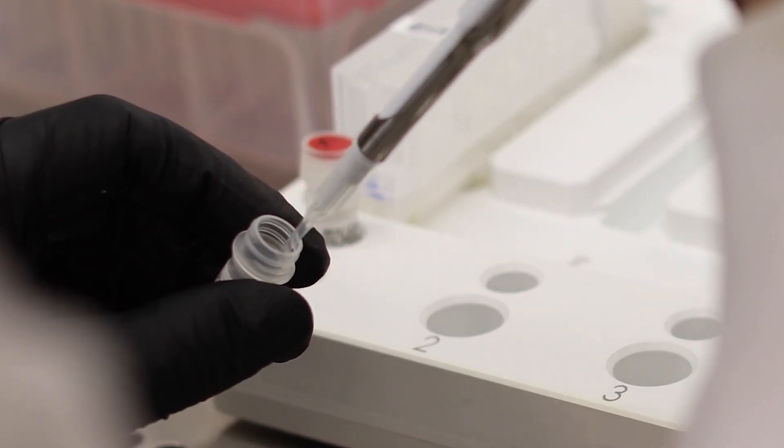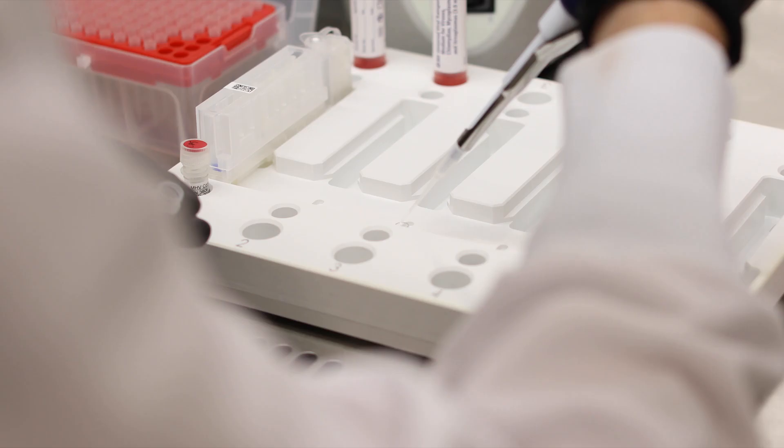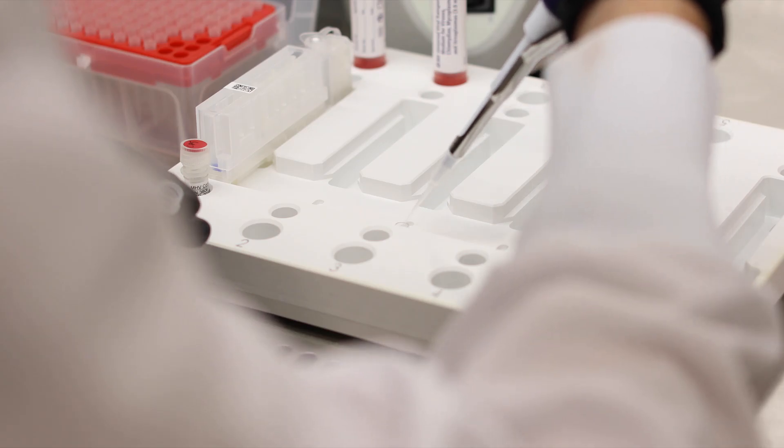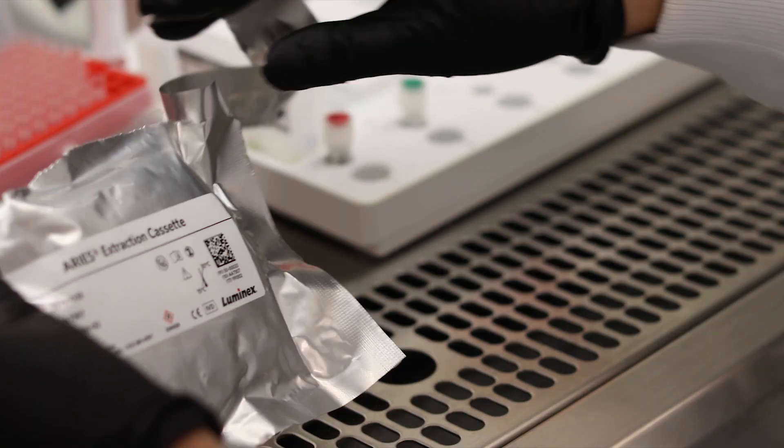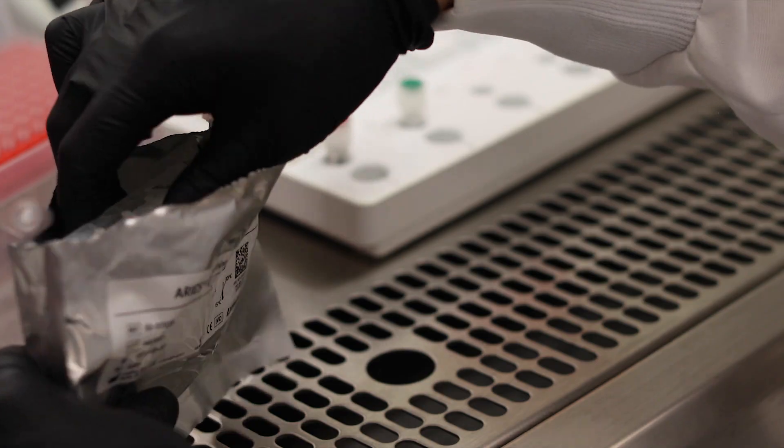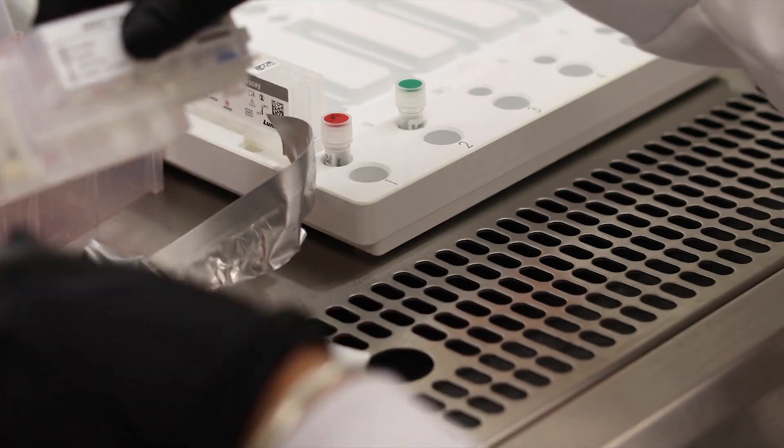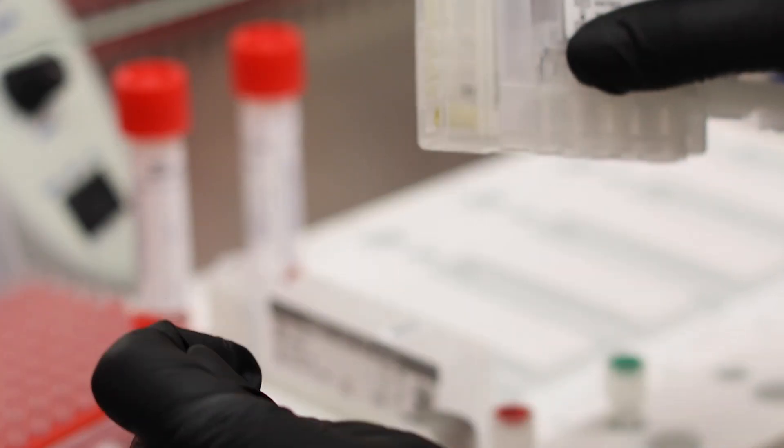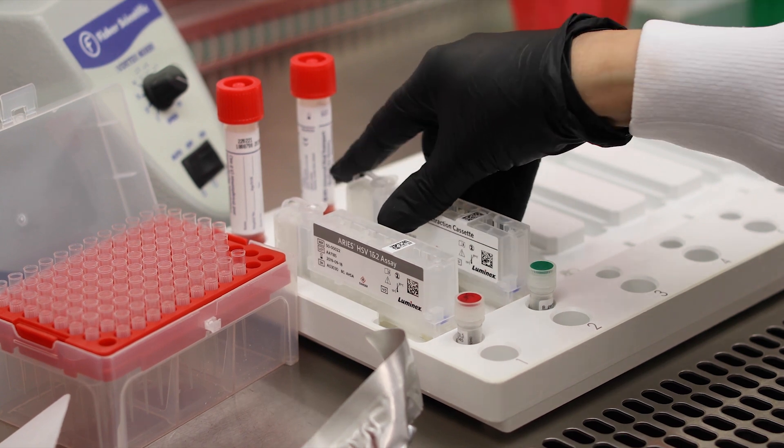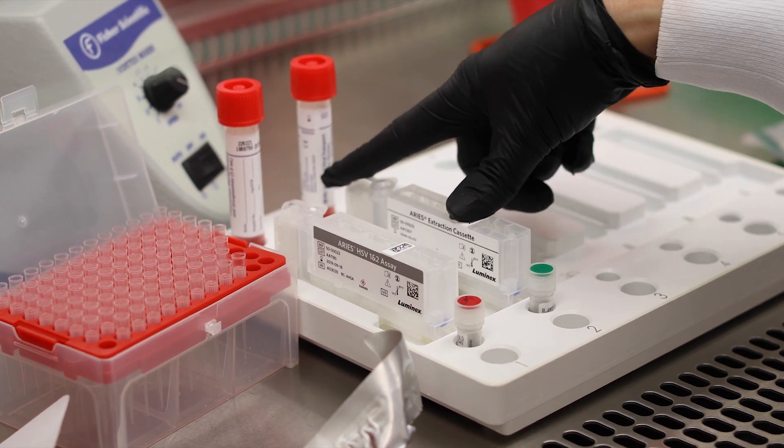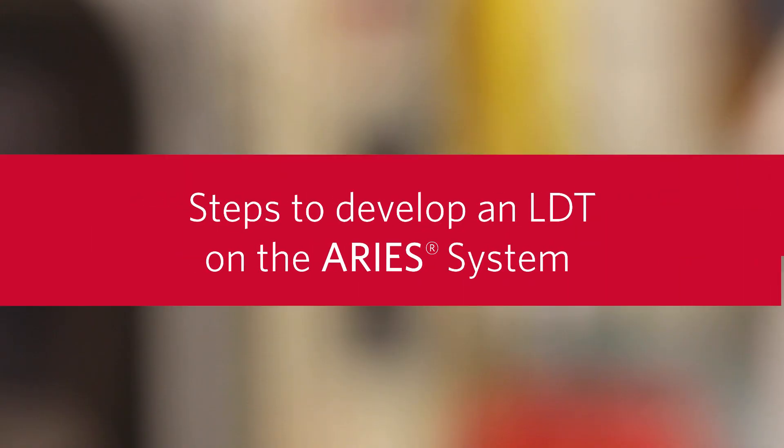Once you have developed your LDT, running the assay is very similar to running an IVD assay with the only difference being the addition of the primers or primers and probes to the ready mix tube and then fastening it to the Ares extraction cassette. In this video we will demonstrate the steps to create your LDT on the Ares system.